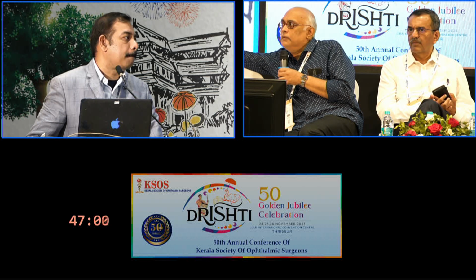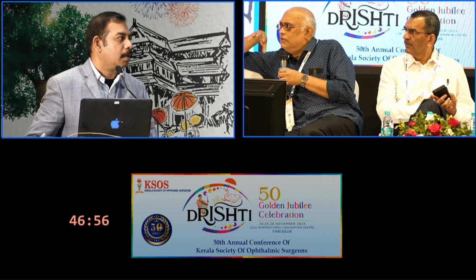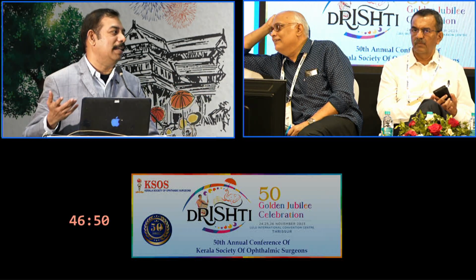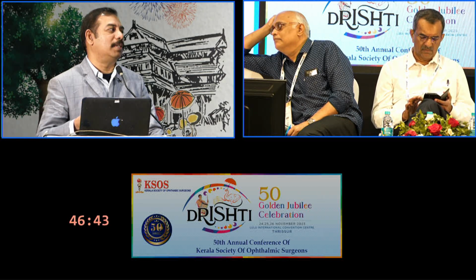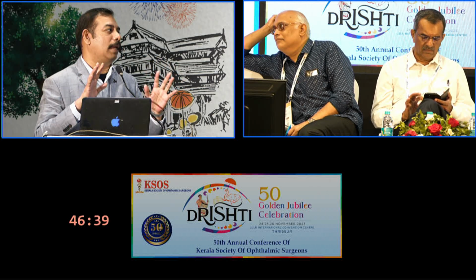How will the emulsified oil particles in the trabecular angle look? That is a very fancy video. I do have one, because that is obviously seen. These things which we really don't see with the naked eye or the slit lamp are what I really wanted to show in this. But that is a very fancy picture. We always try to show the angle foreign body.